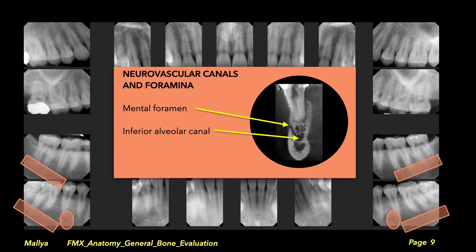The third category of anatomic radiolucencies are the neurovascular canals and foramina, easily identified based on their characteristic location. In the posterior mandible, identify the mandibular canal and the mental foramina bilaterally. The mental foramina are typically located between the roots of the premolars. Often the image of the mental foramen is superimposed over the root apex of a premolar, and it is important to distinguish it from apical periodontal disease. An intact lamina dura and PDL space around the root apices will indicate absence of apical periodontal pathology.